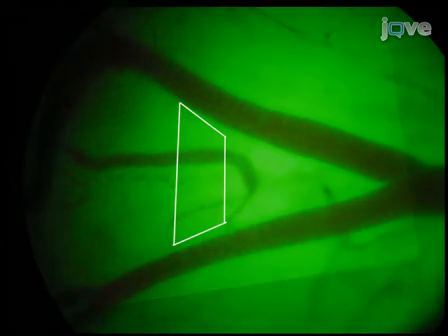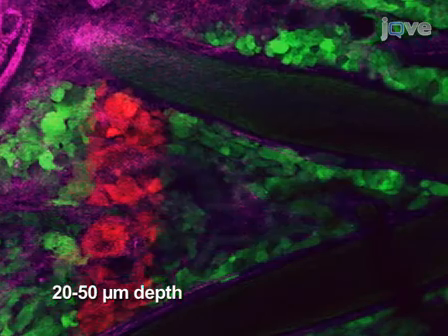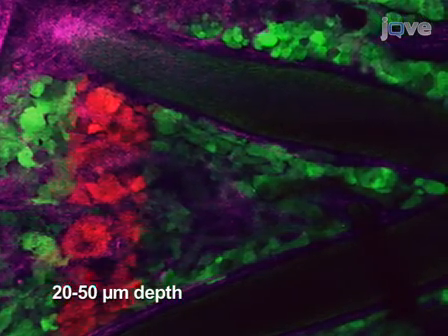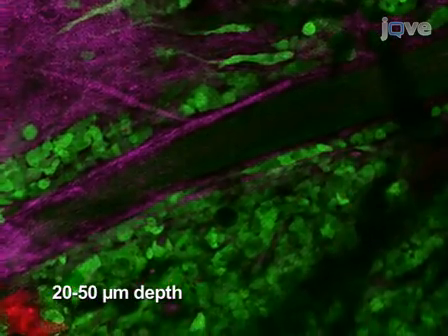In this image, one observes a rectangular photoswitched region oriented orthogonally relative to the blood vessel, which exhibits no fluorescence. Non-photoswitched cells appear green, while the scattering from the extracellular matrix is purple. The image is a maximum intensity projection of 4 images across the Z-axis.